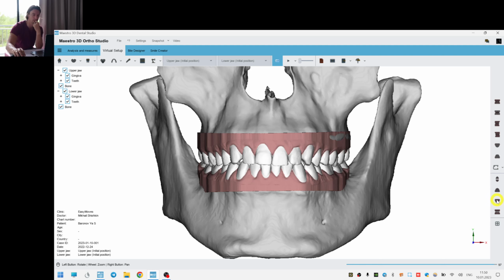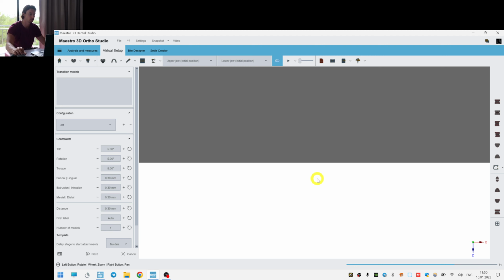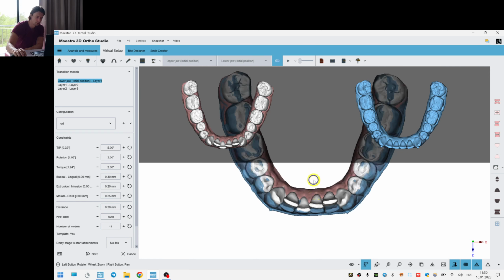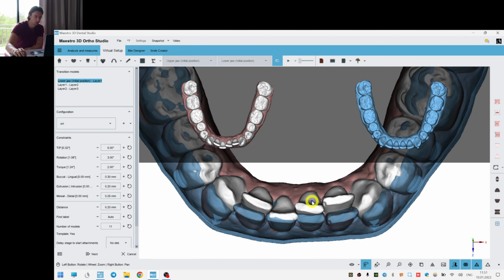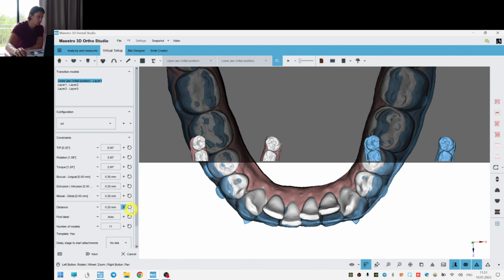I'd also start with the lower arch, because the treatment on the lower arch should be much longer. Well, let's set the distance to 0.2, because for a regular case I would set it maybe 0.25, but here with these huge roots I think 0.2 is fine. Maybe we could even reduce to 0.18.